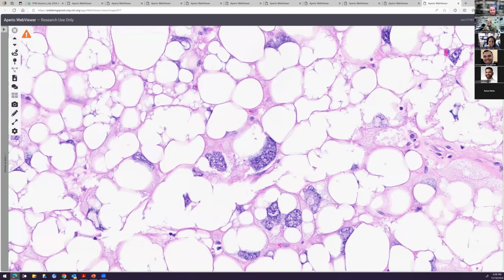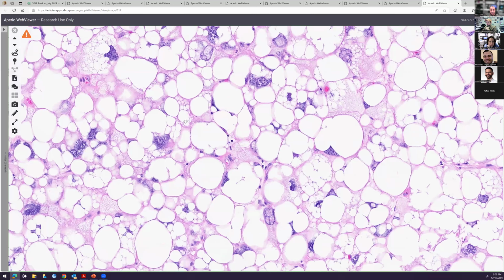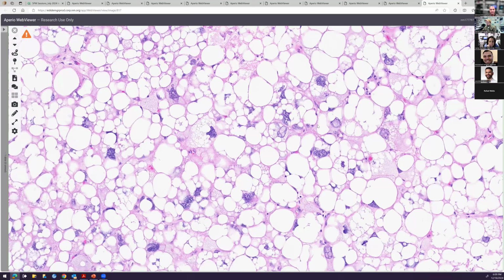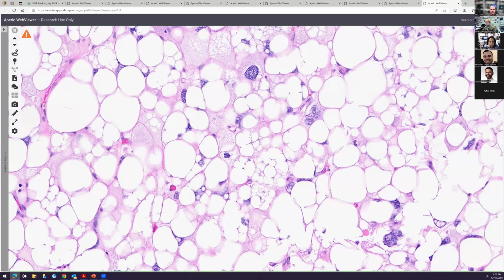Exactly. So this is an example of a pleomorphic lipoblast, right? To get that diagnosis, you're finding multivacuolated or univacuolated cells with a hyperchromatic atypical nucleus. That's what we call a pleomorphic lipoblast. This one is chock full of them. So what's your diagnosis? Pleomorphic liposarcoma. And you would be right, exactly.